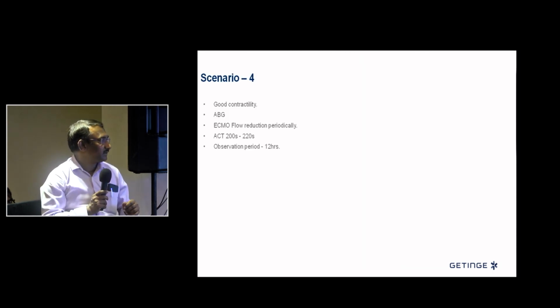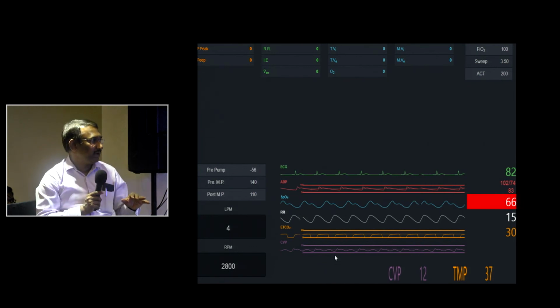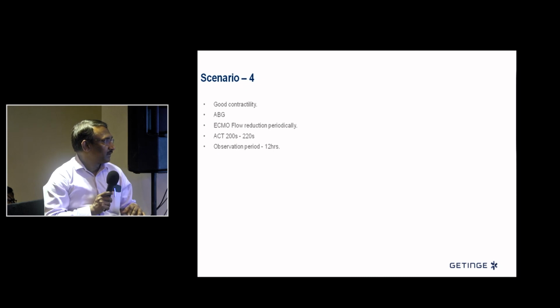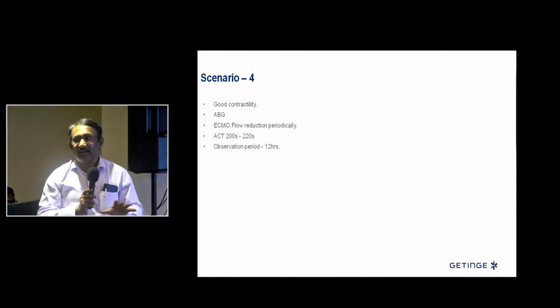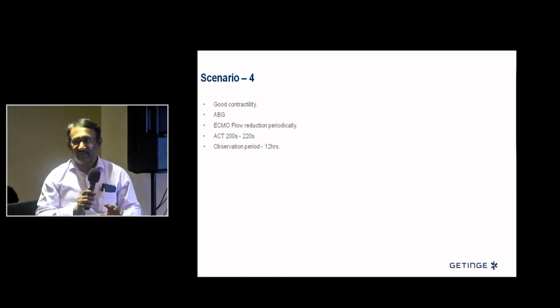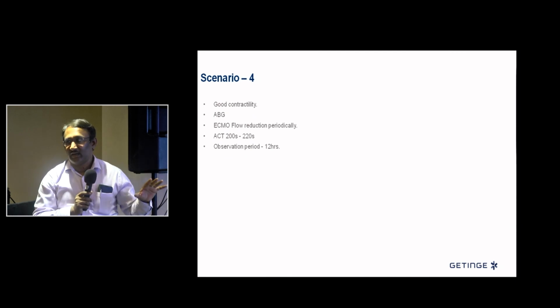Go ahead, next one. So this is finally the scenario where you commonly see where you will be able to wean the patient. Okay, you serially monitor echo as discussed before. So once you start an improvement in contractility, it may not become 60%. Once you see anything more than 25-30, you're good enough to consider starting inotropes and then if possible float a PA catheter and get the numbers out of it and then start making your weaning trials. What is important here is target a higher anticoagulation at that point.